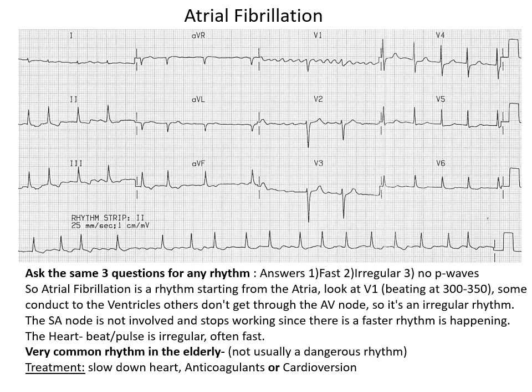Okay, is it regular or irregular? So look at the bottom strip there. Are the QRSs right on time every time, or are they just unpredictably coming? One's coming a bit faster than the other, so the spaces between them are not perfectly regular. So this one's definitely irregular.